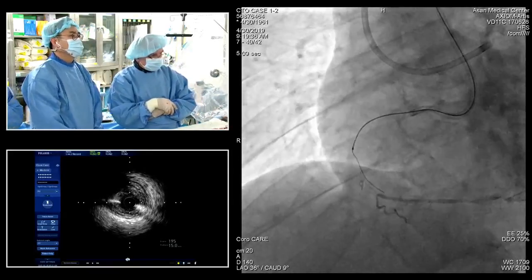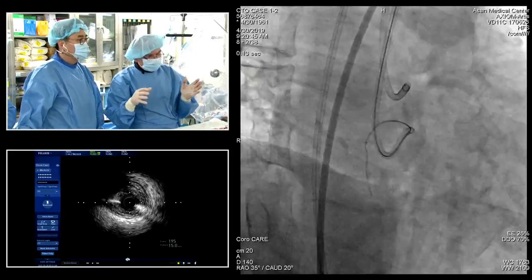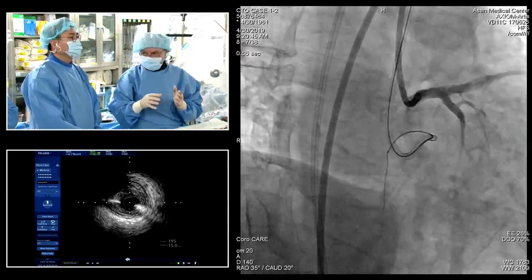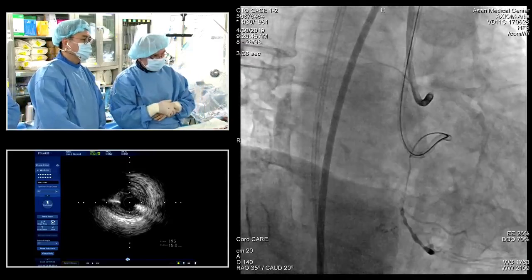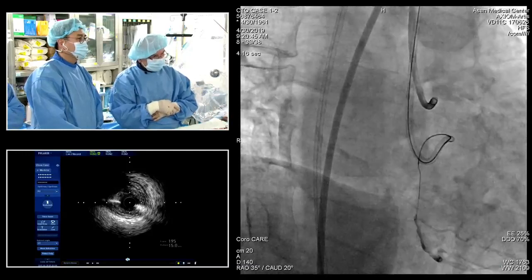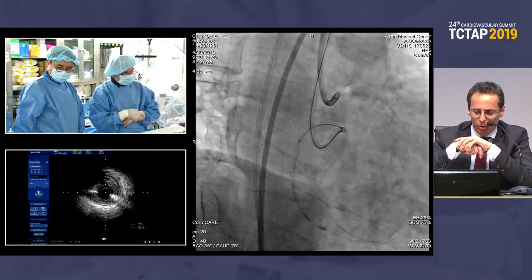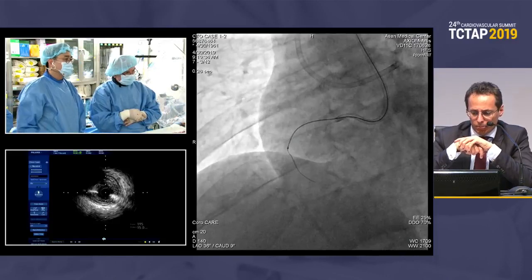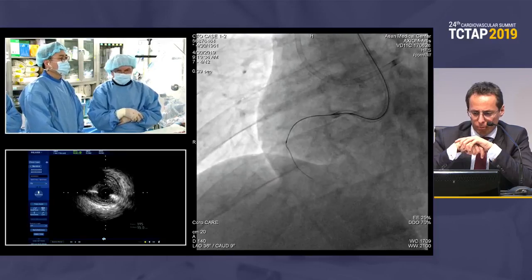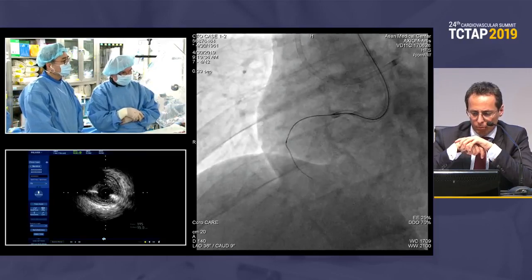And we are clearly in the vessel structure, but too much above. But probably there is a lot of plaque. This doesn't necessarily mean we are subintimal, but we could be in a huge amount of plaque. Gerald, so what is the next step? Good indication for you for going with a parallel now, with a wire with more tip load, or what do you think? Yeah, if I could have advanced the microcatheter, I would have changed to a different wire. But I couldn't advance the microcatheter, so I think this is a good target.